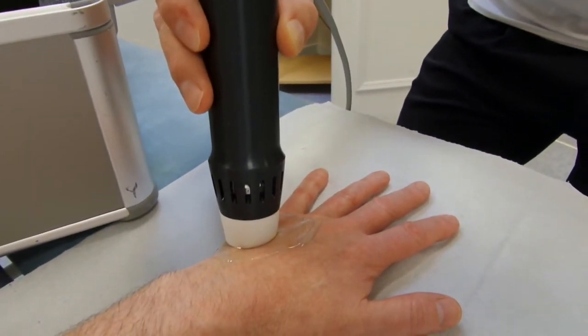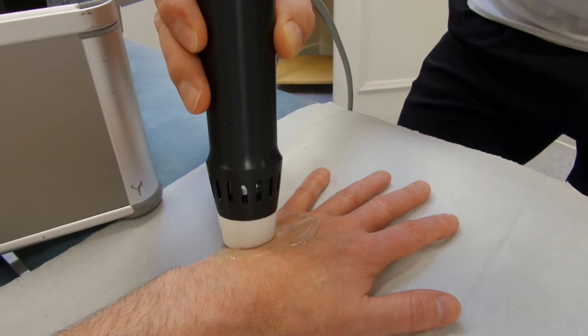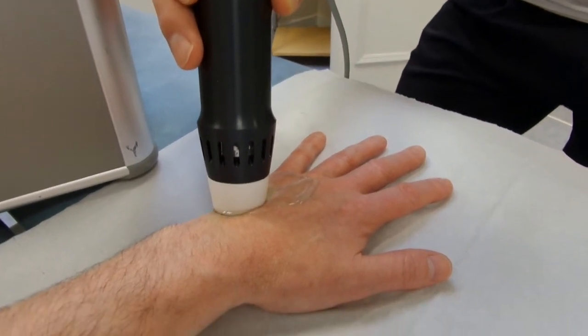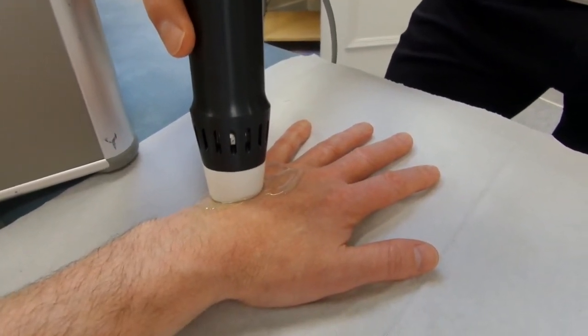You can usually tell if you're on the correct area because the patient will be in pain and obviously show a degree of distress on the face.